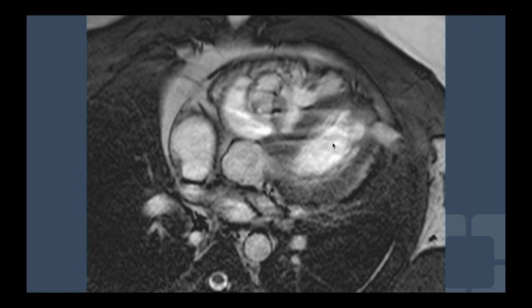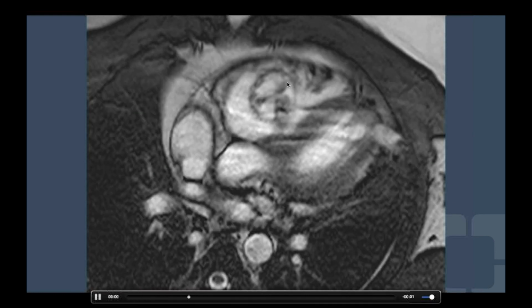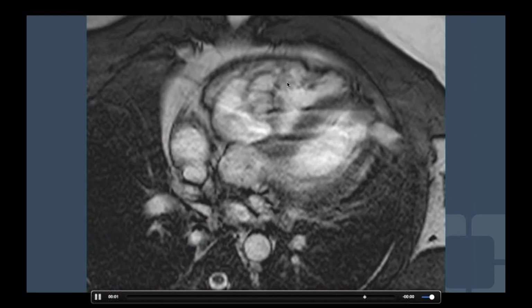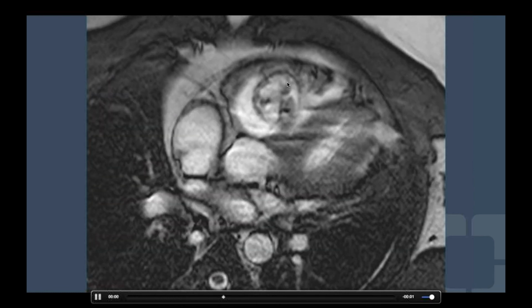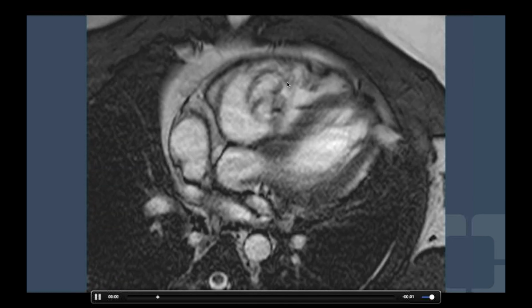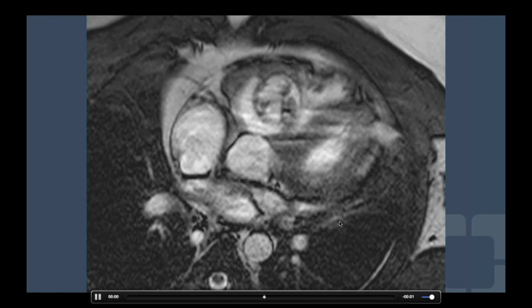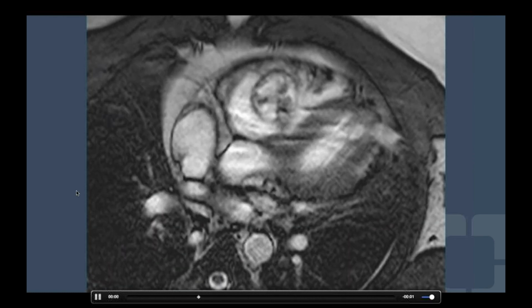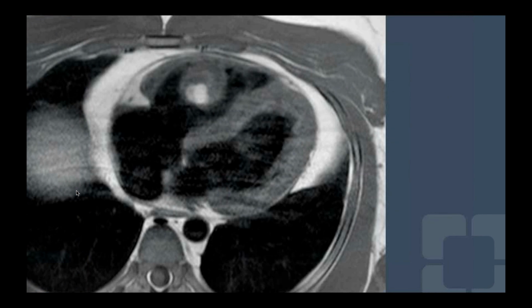All right, let's see. This is a 30-year-old male, no significant past medical history, who presents to the urgent care with headaches and numbness over the right side of the body, otherwise no focal deficits on exam. He was discharged on some medications, returned 4 days later without relief. CT of the chest was done, which prompted an MRI examination. I don't have access to the CT for some reason. I couldn't find it, so I'm just going to go straight to the MR. No chest pain, no shortness of breath. So again, some brief neurotype symptoms, and chest imaging recommended a cardiac MR.